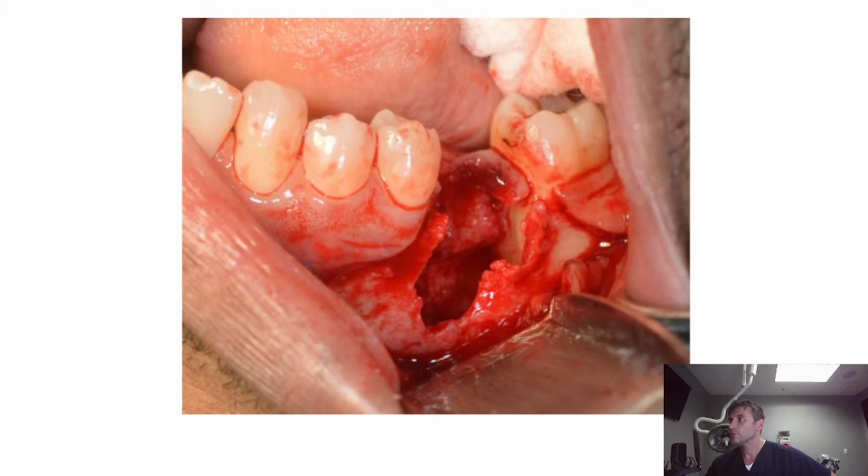For example, if we put a little dental implant right here, we need the native bone cells to grow into this defect around the implant. And this is going to be in the way. There's no way we can grow bone all the way around it. So really, in this situation, we had to build the bone first, and then hopefully we get enough bone growth.